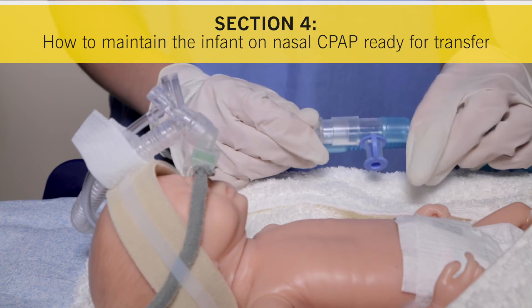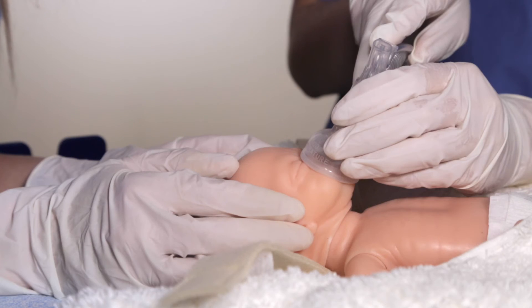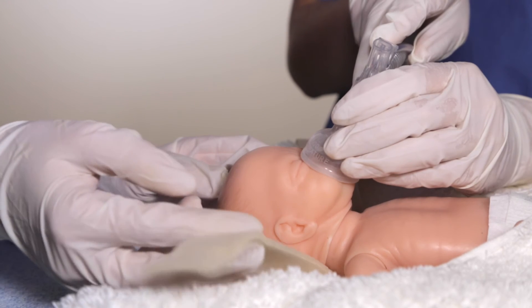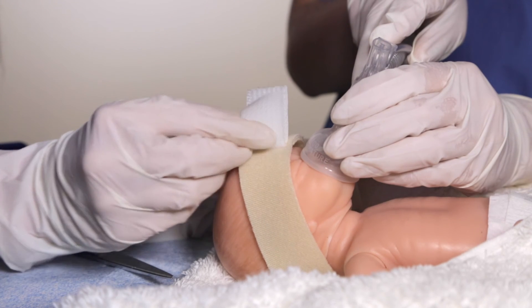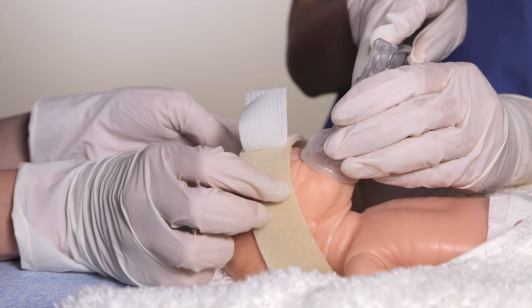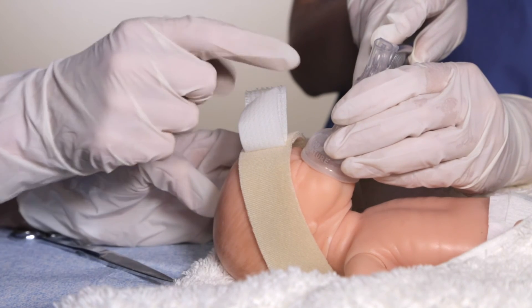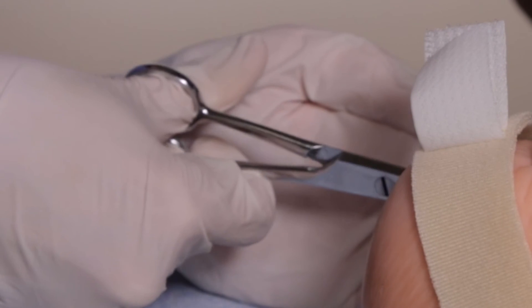Section 4: How to maintain the infant on nasal CPAP ready for transfer. Once stabilised, the infant can be maintained on nasal CPAP. To do this, first fit the headband onto the infant by gently placing it under the infant's head. Pass the headband from the nape of the neck over the infant's ears and secure it using the side tab. Ensure that the central support tab on the headband is in the midline position, removing any excess material with scissors.